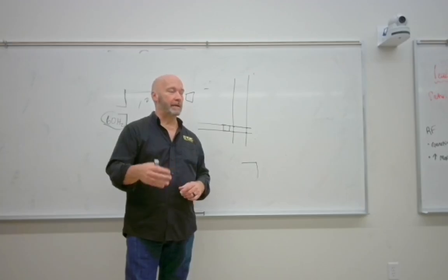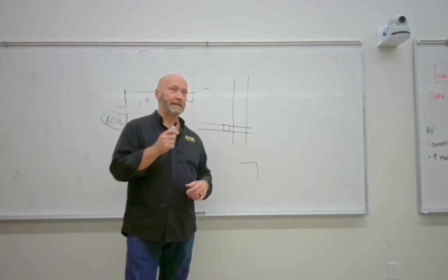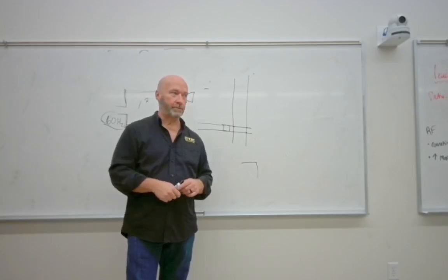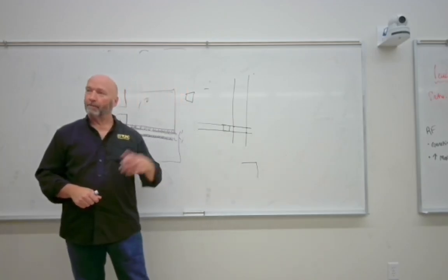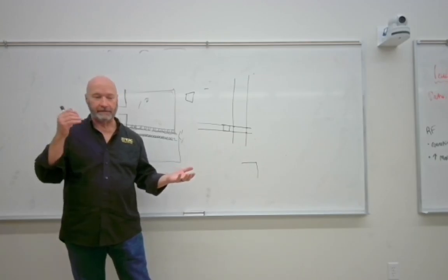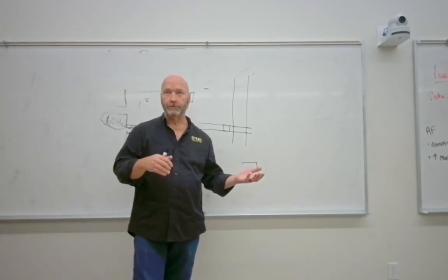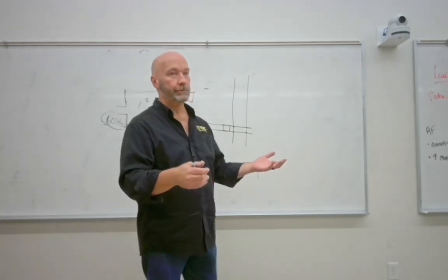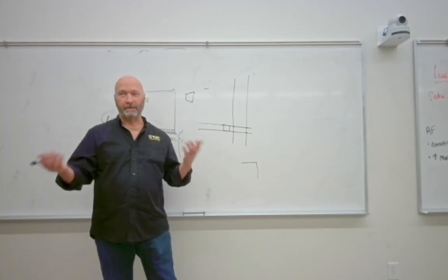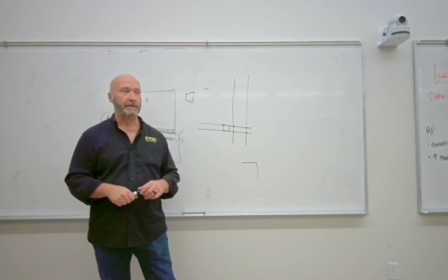Mammo, on the other hand, there is a reason to shoot at 25 kVp, but there's never a reason to use a diagnostic room to shoot mammo. We've got specialized rooms for that. All right, so mammo units, naturally low kVp. Diagnostic rooms, radiography rooms, only radiography rooms are going to be higher kVp, starting somewhere around 40 and going up to 150. You're also not going to use 150.